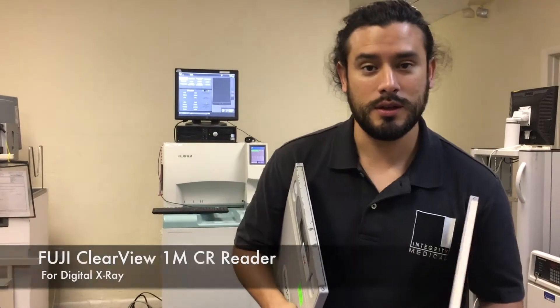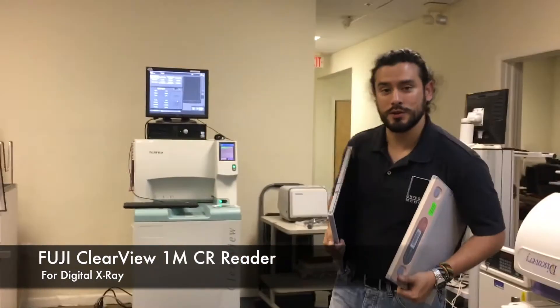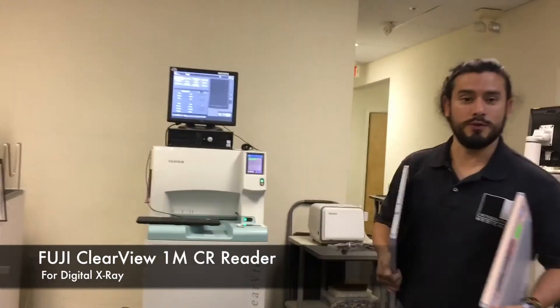Hi. Today in Integrity Medical, we're going to take a look at the CR reader. In this case, we have the ClearView made by Fuji.